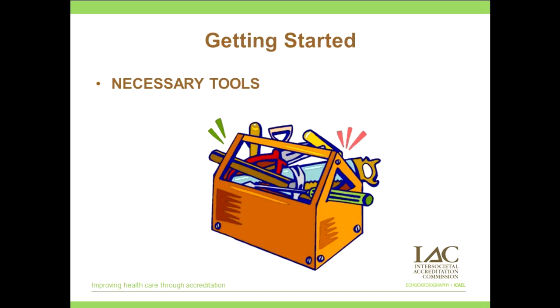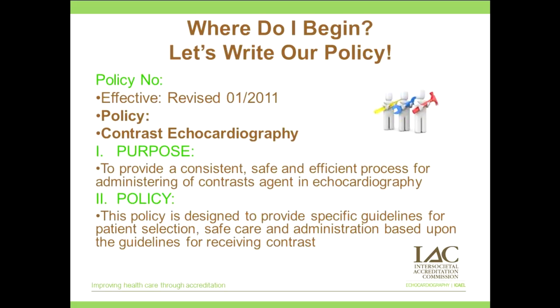So let's get started. I want to begin by talking about the necessary tools that echo labs need. These are the tools that will help you get started with contrast-enhanced imaging. So where do you begin? I think the best place to begin is to write a policy.